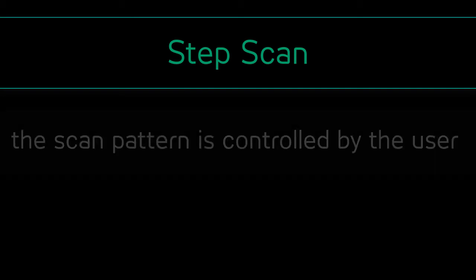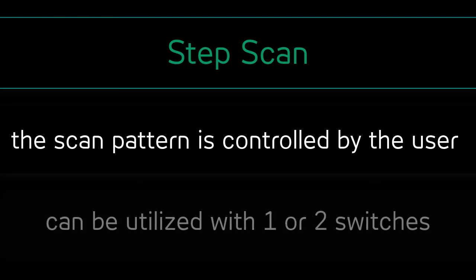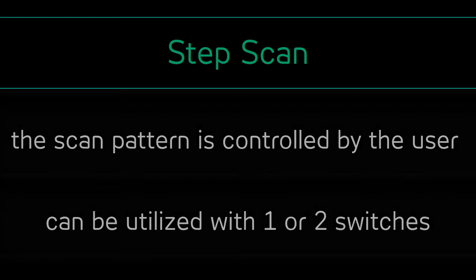The second general scan type category is step scan. With this scan type, the progression of the scan indicator is controlled by the user. This scan can be utilized with a single switch or two switches. The switches are used to progress the scan and make selections.